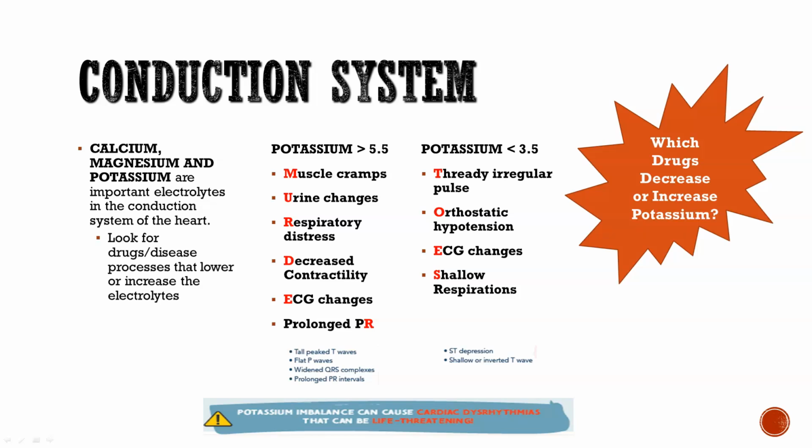So notice that when you're looking through here, this just basically means you have a bad pump, and this basically means a dysrhythmia. This is a dysrhythmia, and this means you have a bad pump. So I look for those things that are consistent for those disease processes.